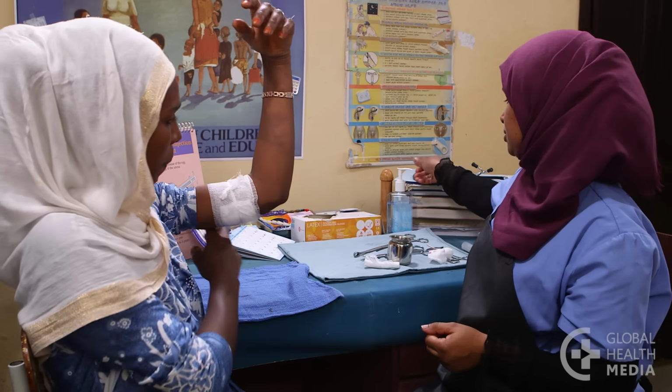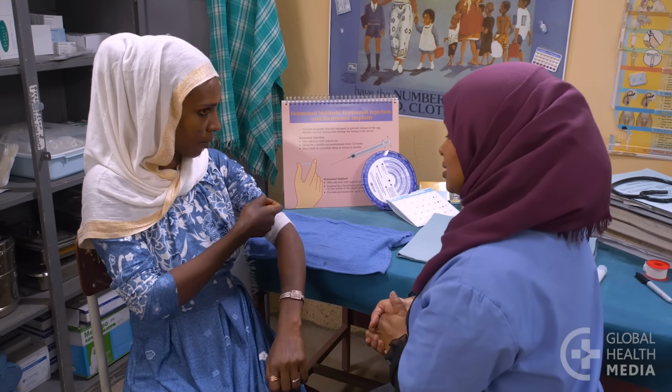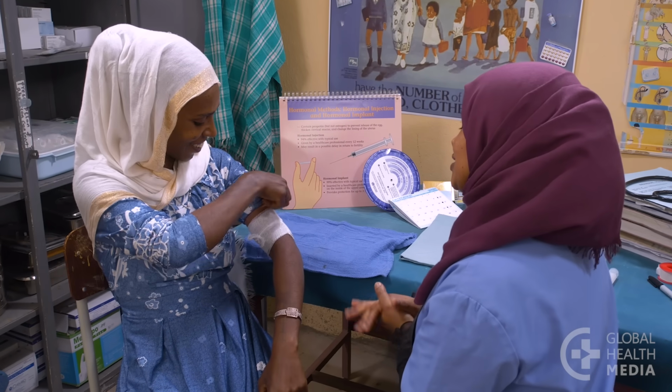Advise the woman to keep the site clean and dry for 2 days. She can then take off the outer gauze dressing. The tape can be removed in 5 days after the wound is healed.